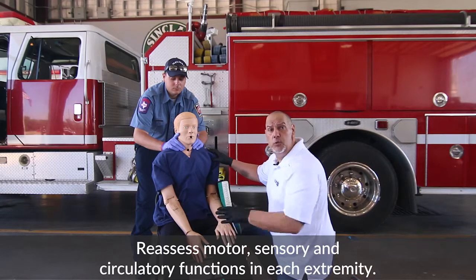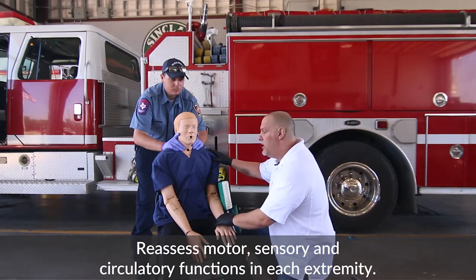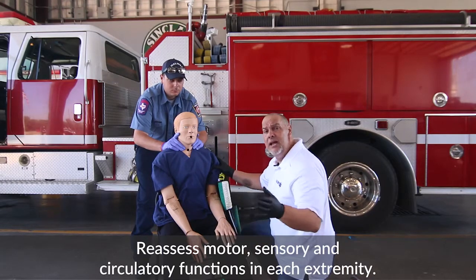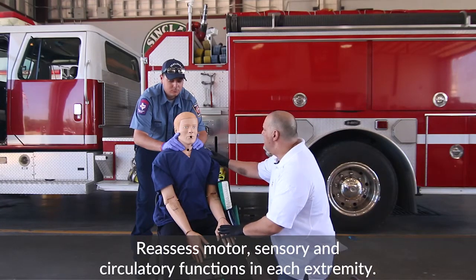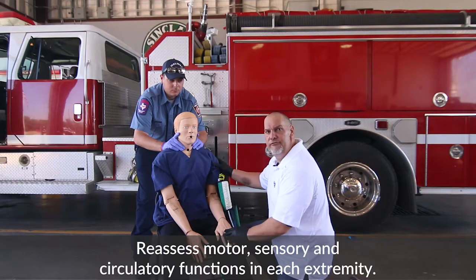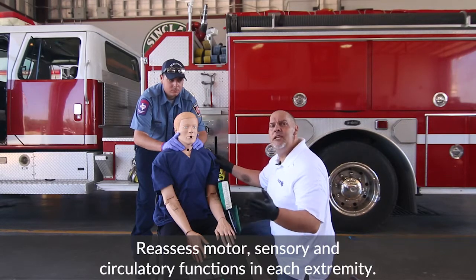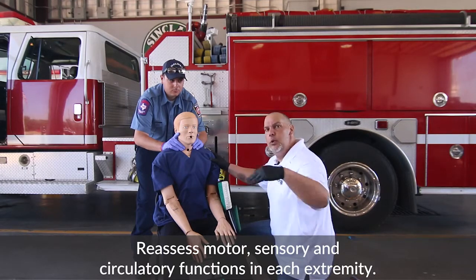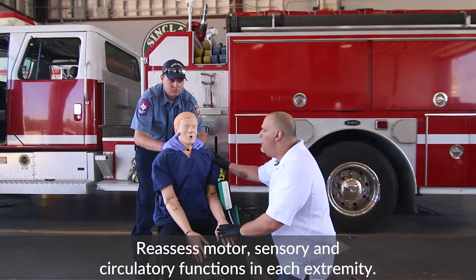The next thing we want to do is check CMS — we want to make sure that there's good circulation, that they have good movement, and that they can feel us touching them. Remember, you don't want to say to the patient, 'Can you feel this? Can you feel this?' You actually want to say, 'Let me know when you feel me touching you.' Because if for some reason they don't feel that, you're going to put them into another level of stress that they don't need.